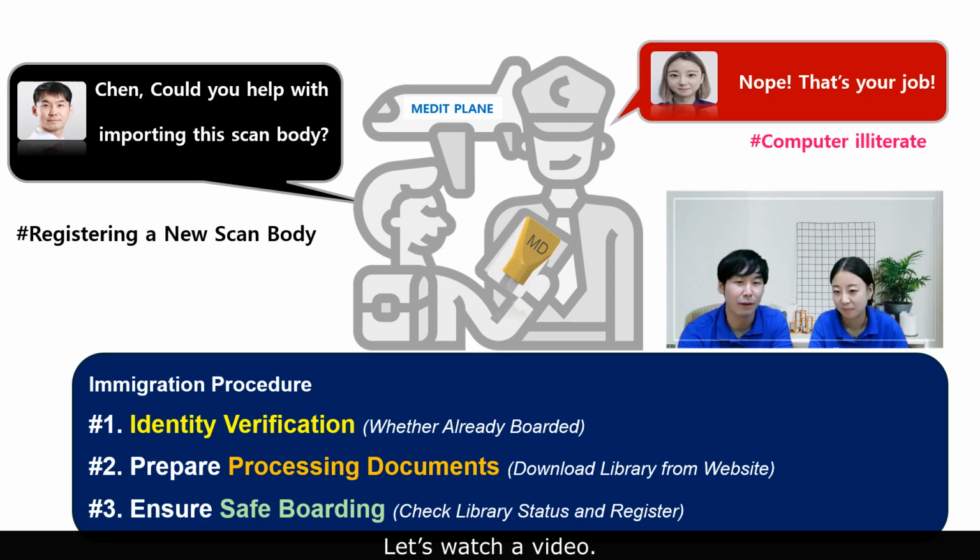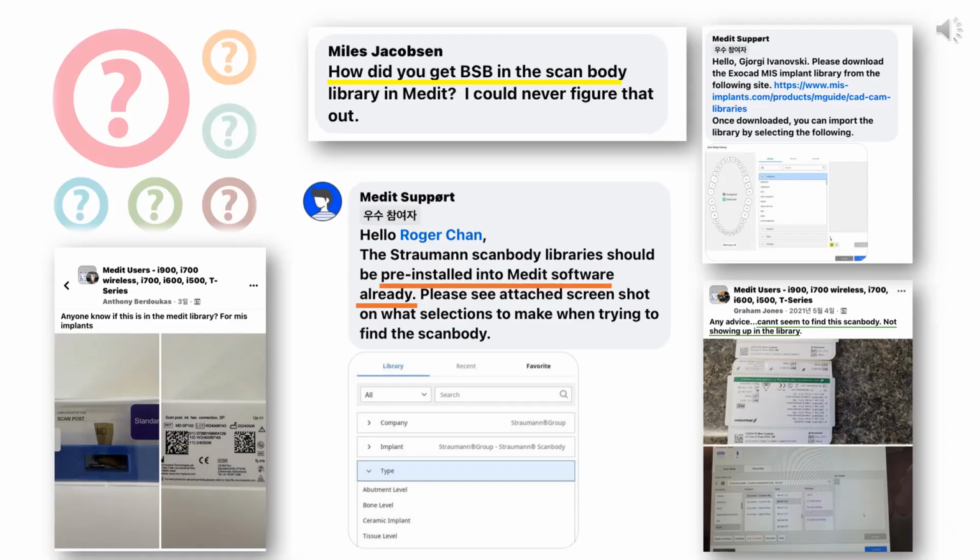Let's watch a solution video. Questions about the scanbody library are among the most frequently asked in the Medit Facebook user community. Although there are numerous questions posted about various types of scanbodies, the method for registering the library is actually the same. It is simpler than it seems once you understand the step-by-step procedure. Let's go over the steps and the important points to keep in mind at each stage.